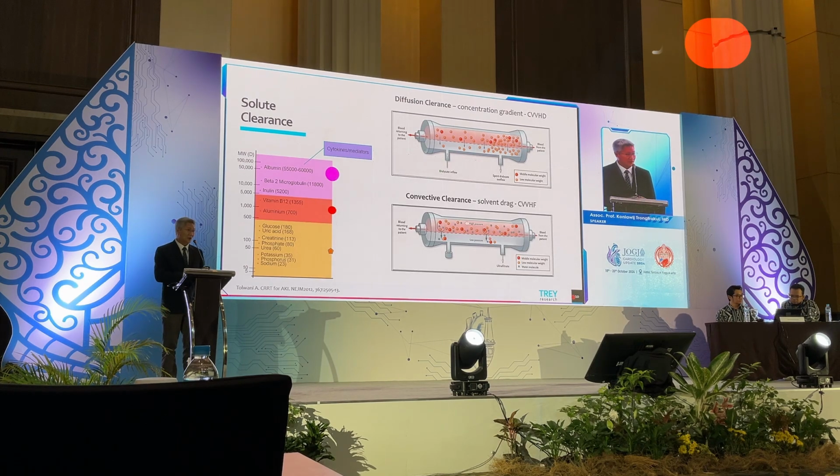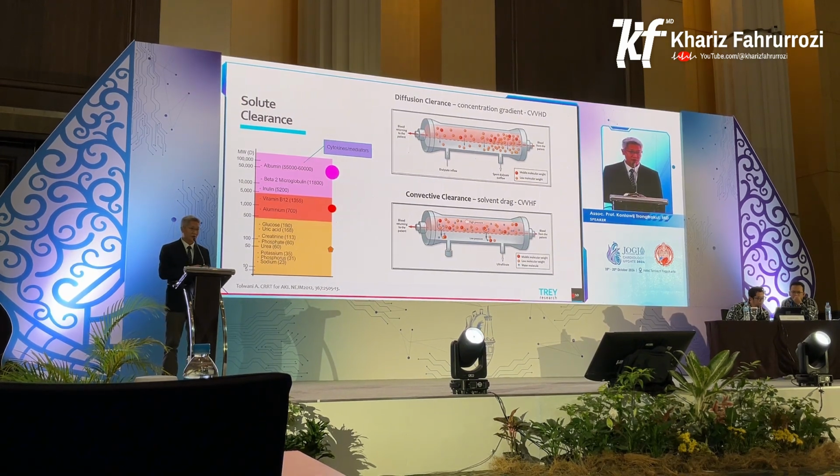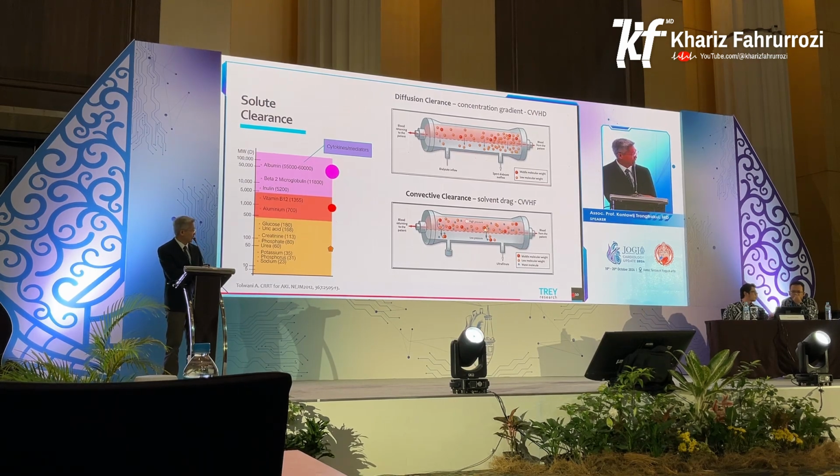For the second technique we call convective therapy. You can see that this technique also has a membrane, but we need to create pressure on the patient's blood side, so the hydrostatic pressure increases inside the membrane. Fluid will shift through the membrane and drag some solvent and solute, especially small and middle molecules, from the patient's blood.